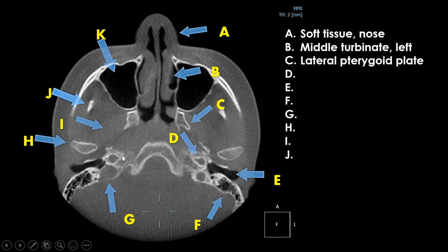D, I'm going to drum these into your head because these, along the length of this canal, when it comes upward towards the sphenoid sinus, I see plaques and medial arterial calcifications. I see things that you need to recognize and have a referral made to the primary care provider. So this is the opening for the internal carotid artery.